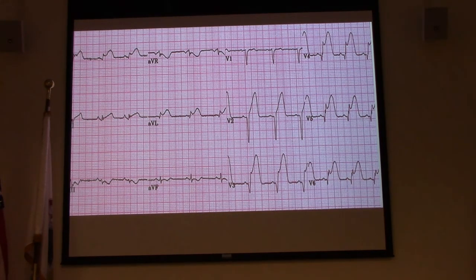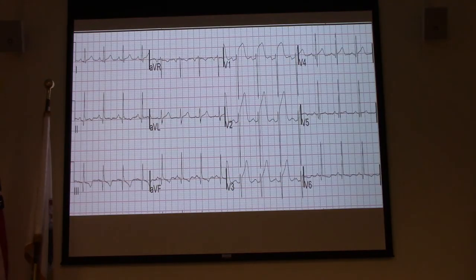Our elderly patients, if they say, oh, I don't feel quite right, I'm tired, I've been exhausted. All of these are anginal equivalents, and we need to run 12 leads on them. And the sooner you do them, they should be done bedside, the sooner you can get nitro on board, the sooner you're going to get oxygen to areas of the heart that are injured or irritated at that point.